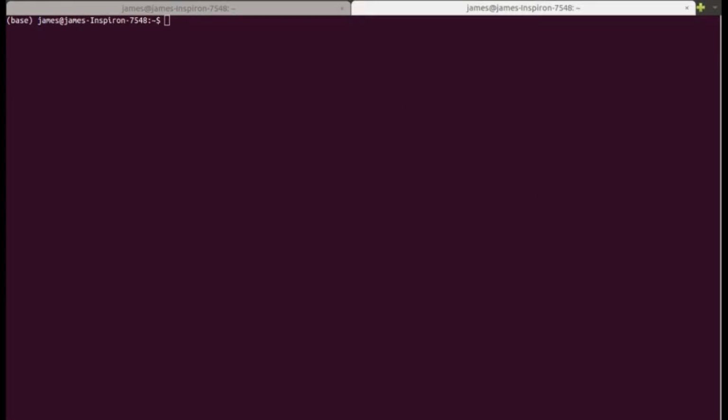Hello, fellow neurohackers. Today, I just want to cover some FMRIPREP development.